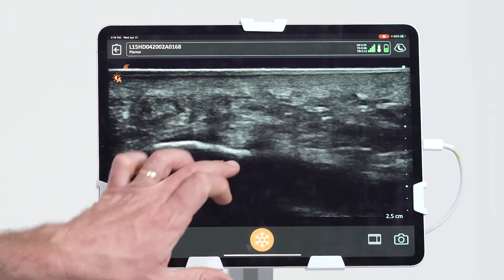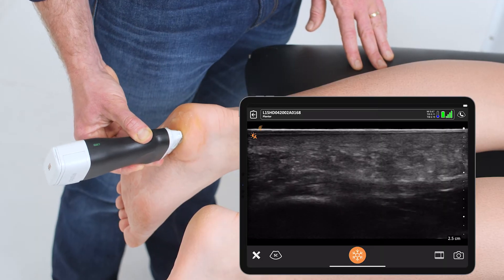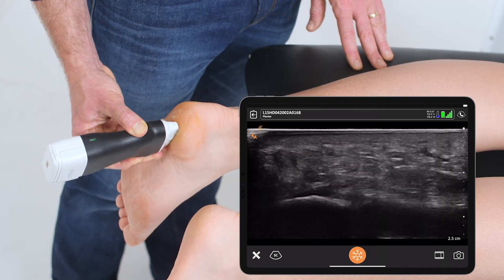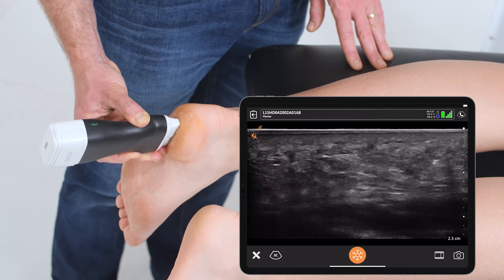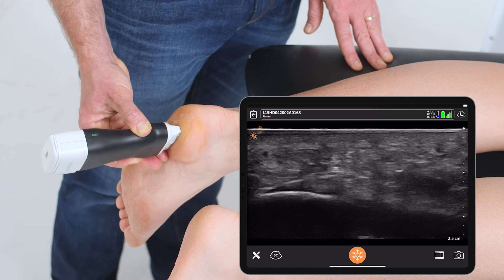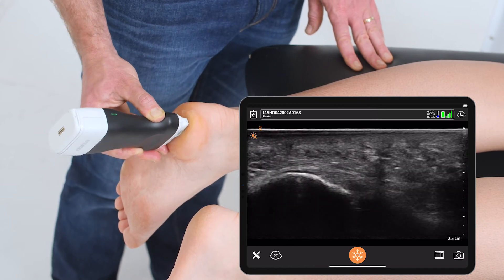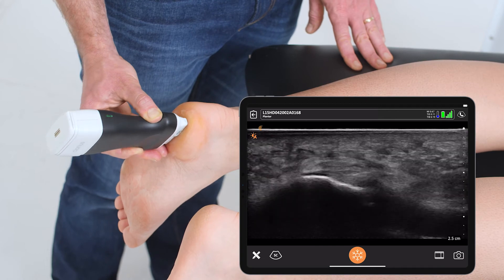The scan is completed by making sure that I visualize the entire lateral aspect, going all the way to the medial and lateral aspects of that plantar fascia. I can rock the transducer back and forth to make sure that the fat pad is nice and supple just outside of the plantar fascia itself.